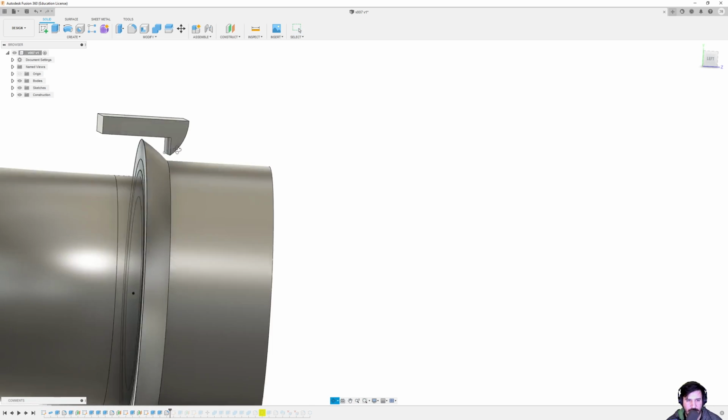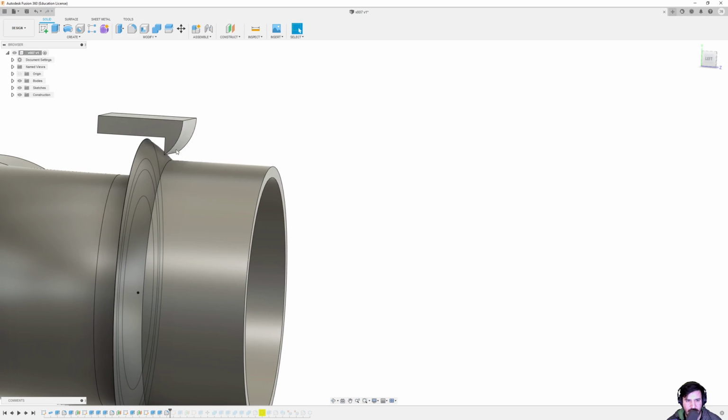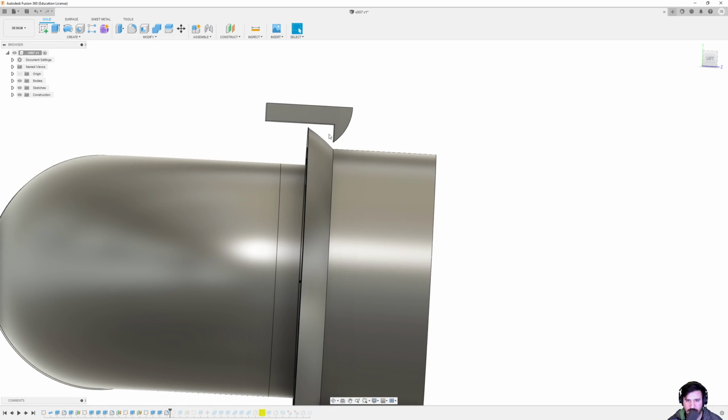Next, I made a fillet. Yes, fillet. On that edge there, just to make it smooth. Again, the part of the mask ends up sitting right here. So this actually helps push that upward instead of it just being flat and potentially breaking off this underside. It actually helps flex that out a little bit.